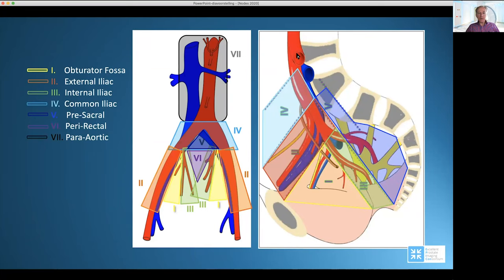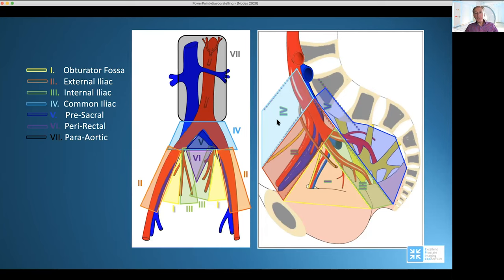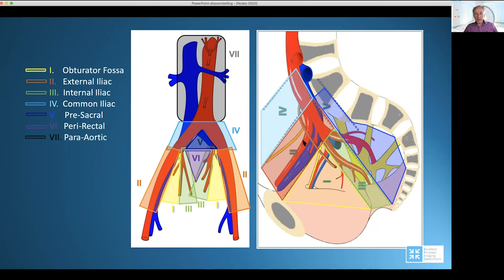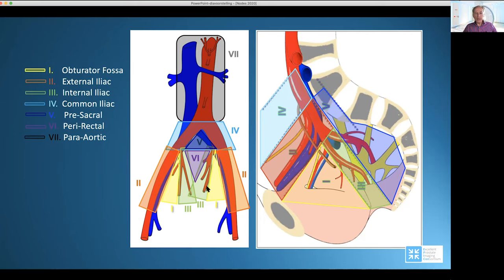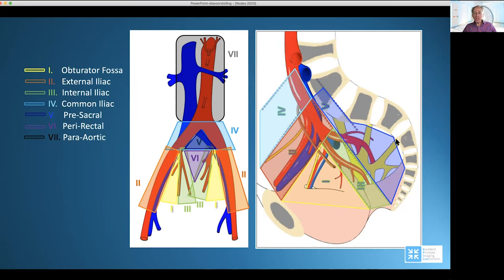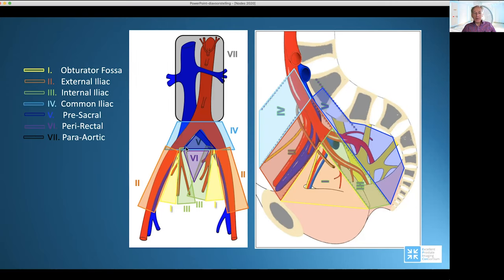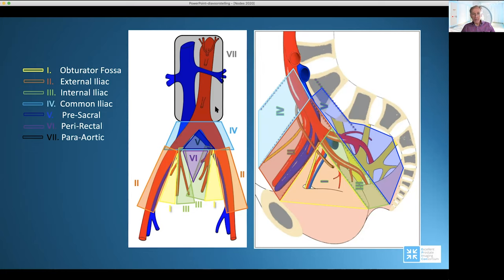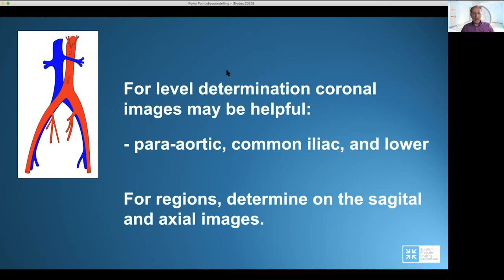In a schematic drawing: the common iliac plane is the light blue area, orange is external iliac, yellow is obturator, green is internal iliac. Over here is the presacral region, down in the pelvis is the perirectal region, and above is the para-aortic region. To determine the level of your axial images, a coronal localizer is very helpful.